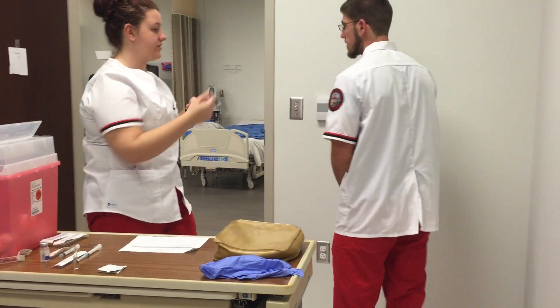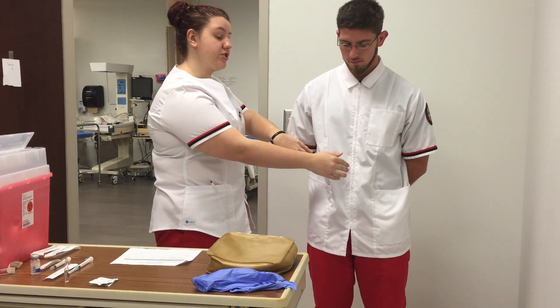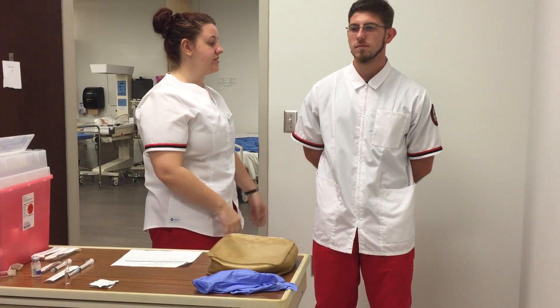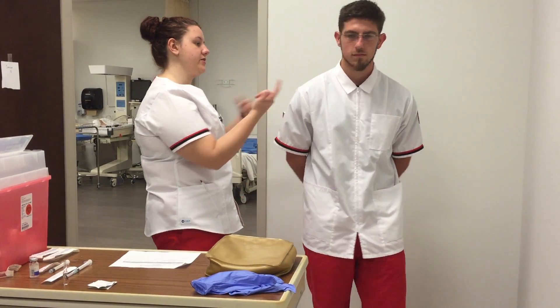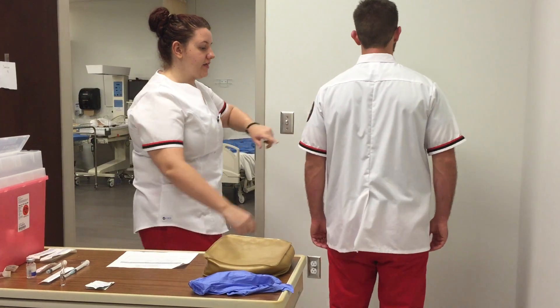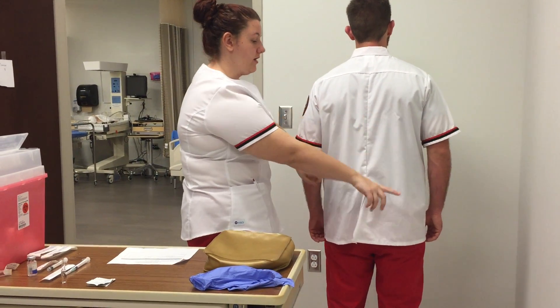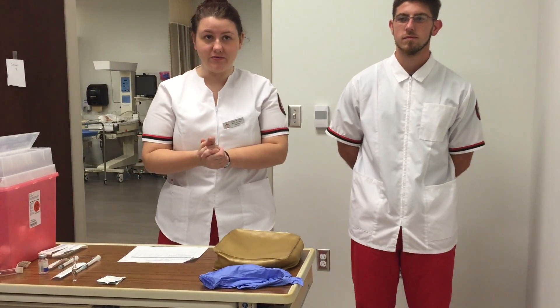Be careful not to go too far down to avoid the sciatic nerve. For the subcutaneous injection sites, I would inject in the stomach two inches away from the umbilicus, in the upper and lower quadrant, and the top of the thighs where there is adipose tissue. And turning around, the posterior of the upper arms, the upper back, and the lower back — those are all the subcutaneous sites.